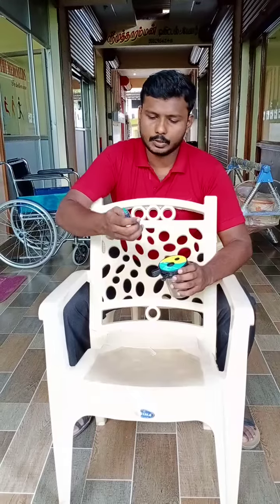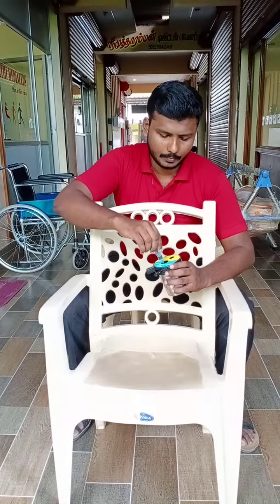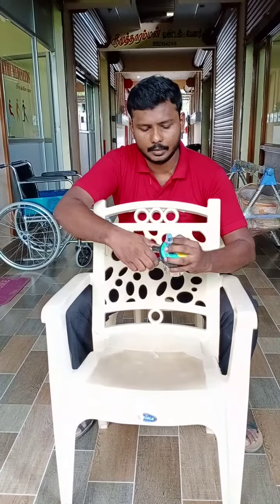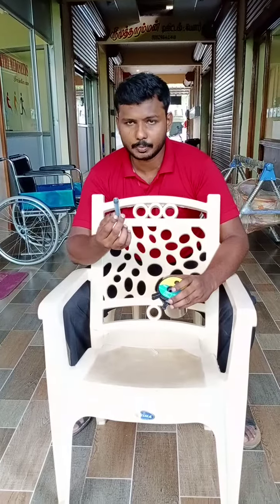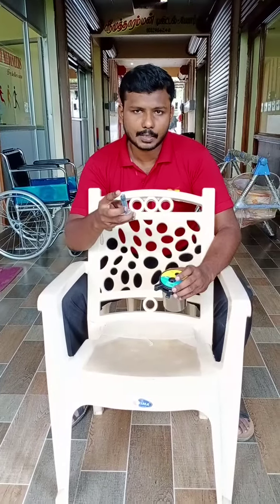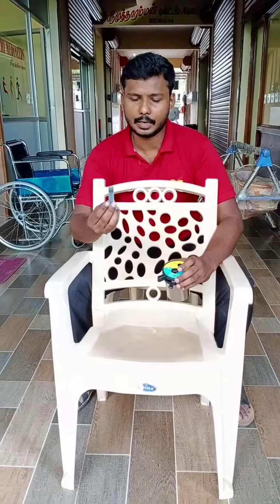When inserting the barrel, the top of the barrel is what you want to insert into the barrel cutter port. If you press again, the barrel top will also be cut down, so that no type of contamination, blood, or anything will remain in this barrel.